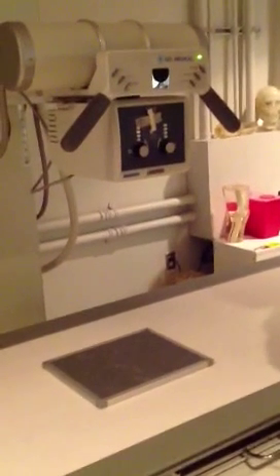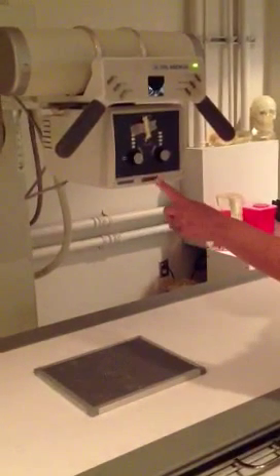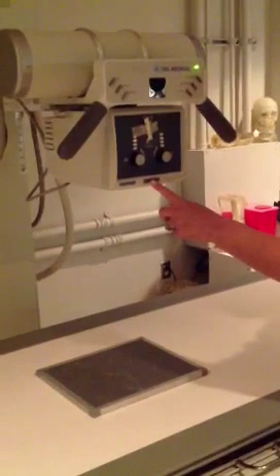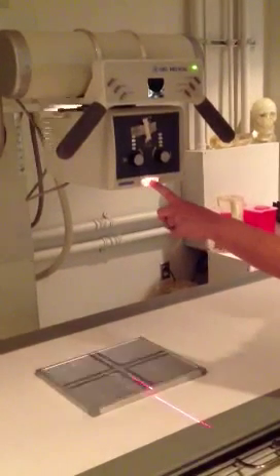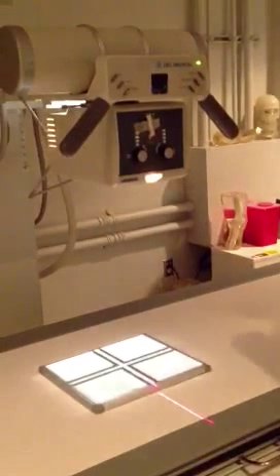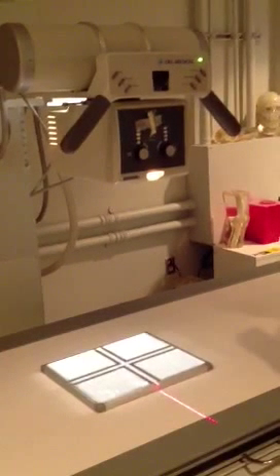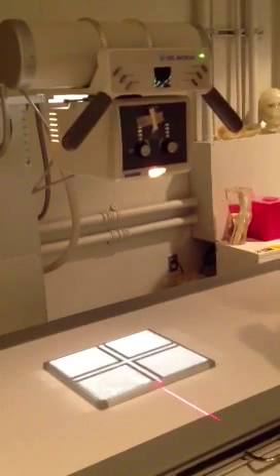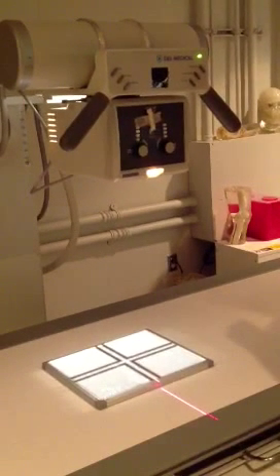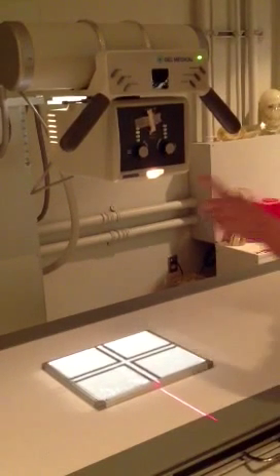Alright, the next button we're going to talk about is the one that turns on the light so that you can visualize where exactly your exposure is going to be coming across the patient.